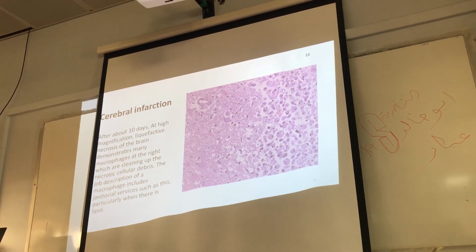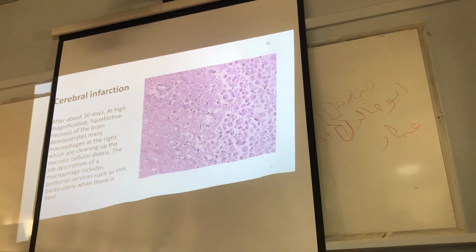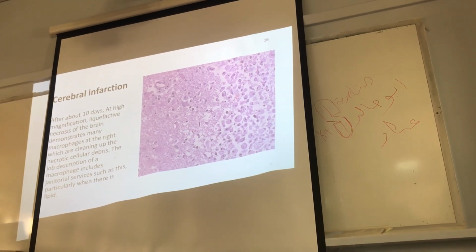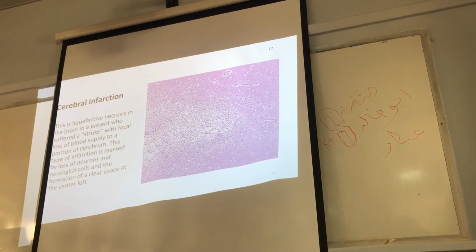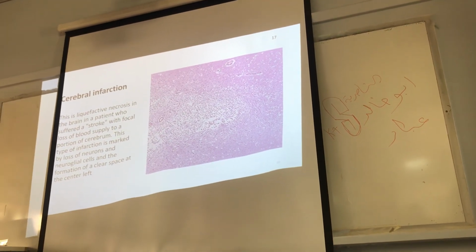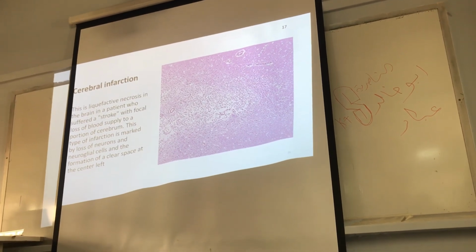This is a case of cerebral infarction. The day is about 10 days, not early, so macrophages are cleaning up the debris. The ultimate result is the loss of brain substance.